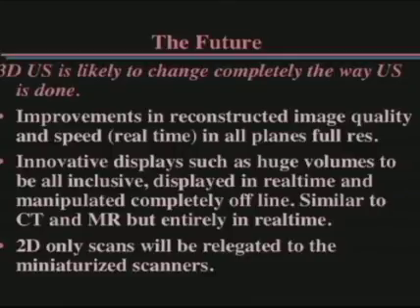So what do we have in the future? Well, I think 3D ultrasound is likely to really change completely the way ultrasound is done, and certainly the way ultrasound is archived, so that we don't have to take one little slice at a time, but we can take volumes and archive the slices that we want. Improvements in the reconstructed image quality, the speed and the real time is going to be available in all planes with full resolution. That will be even better than we have it today.